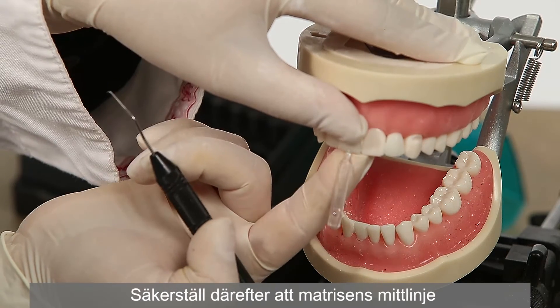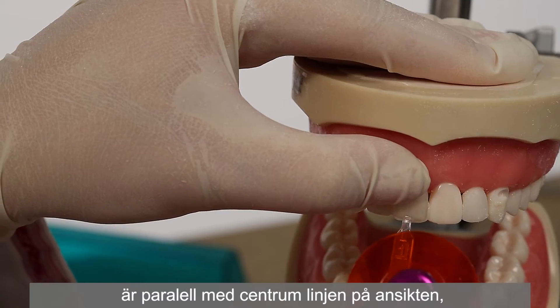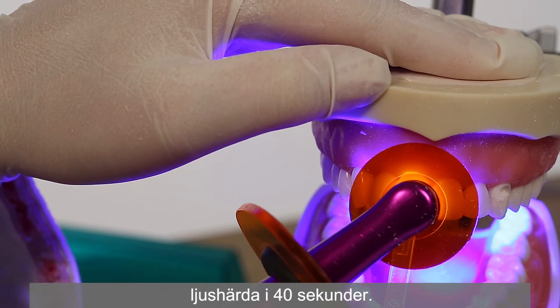Then, making sure that the center line on the template is parallel with the center line of the face, light cure for 40 seconds.